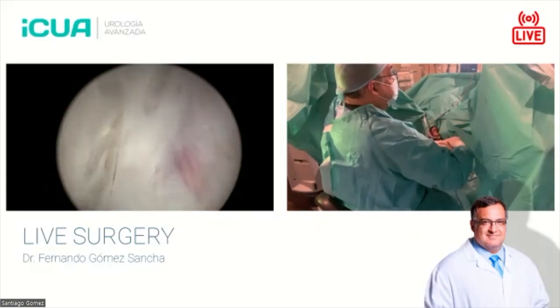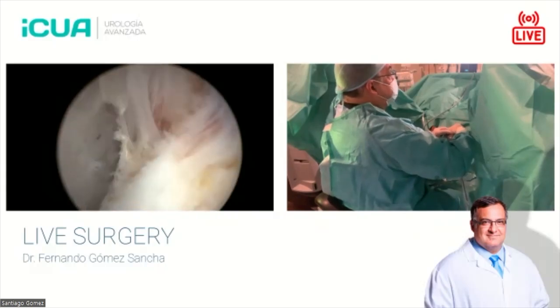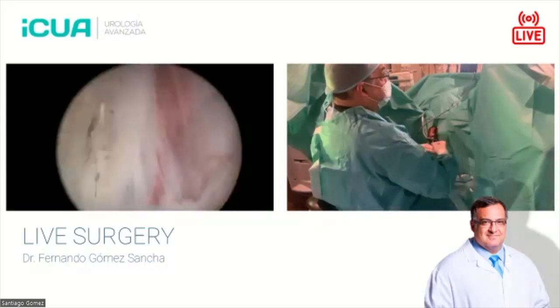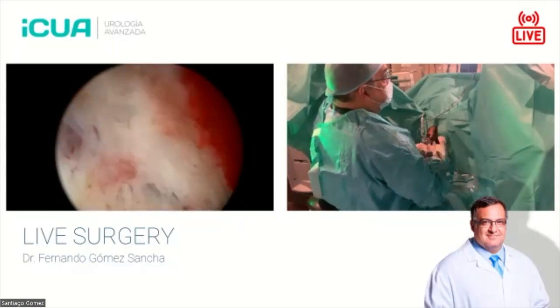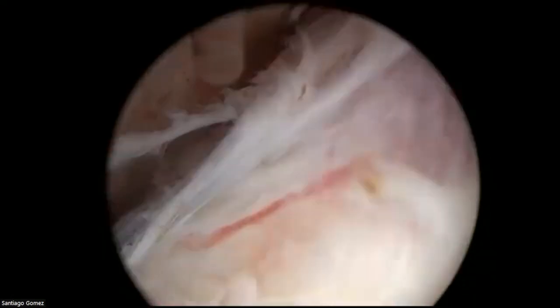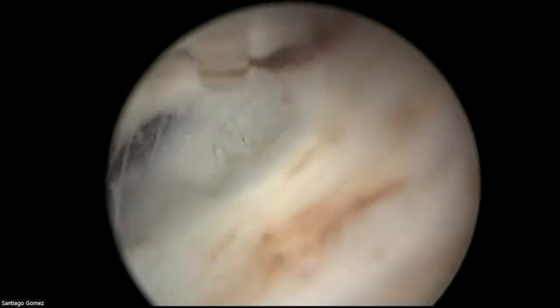Okay, this is the careful approach towards the anterior part. We have dissected initially a little bit of the lateral aspect. Then we came out again to check that the apical attachments, you see, this is an apical attachment, this is a sphincter, are not limiting me. So if I can come up here, which would be probably around 11 o'clock, then I can come towards 11 o'clock as I go deeper towards the bladder neck.